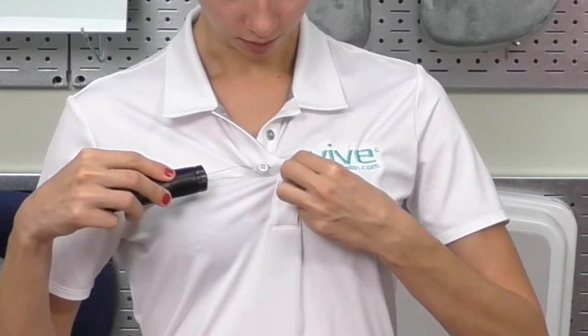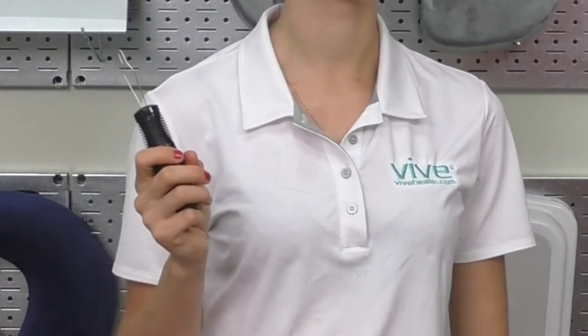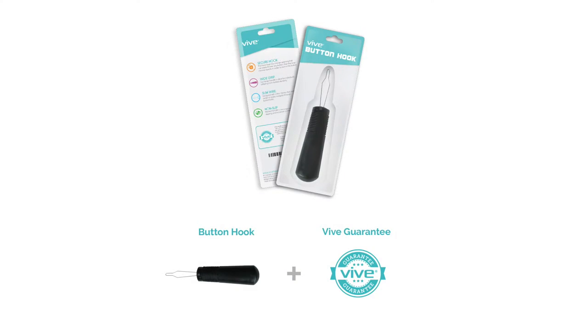Our slim wire and smart hook design make the process of navigating through the buttonhole and securing the hook around the button as simple as possible, and is protected by our Vive Guarantee.